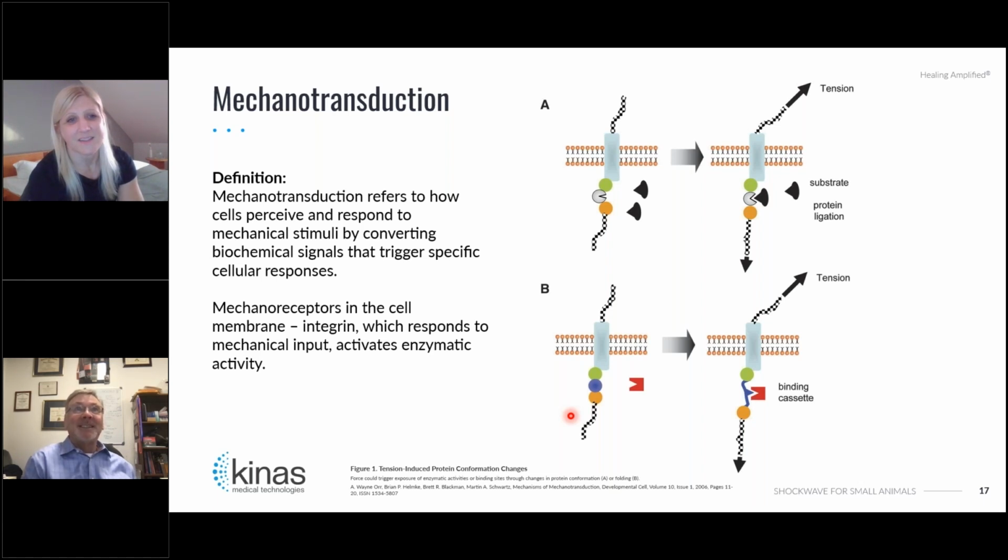Yes. If you look at physics, there is a difference in how it spreads. And there's also a mechanism. So it's mechanobiology and mechanotransduction, how you can affect cells as well. It's not only that we have a transporter system into the cell on a chemical side or currents. We also have a mechanical approach to the cell, tension, pressure, push and pull, that can affect cell metabolism. So you will get a biochemical signal response through this mechanical approach to the cells as well.